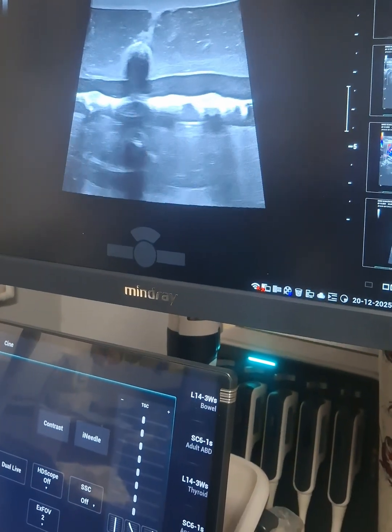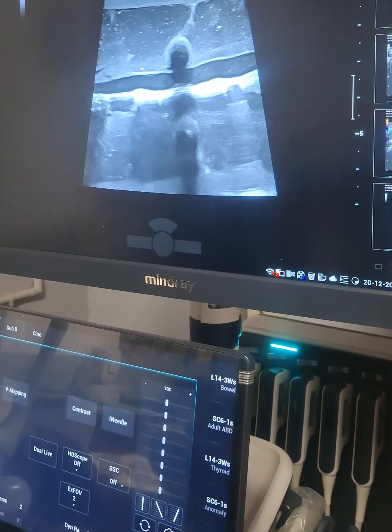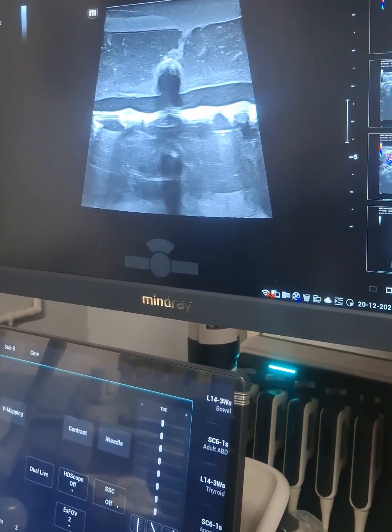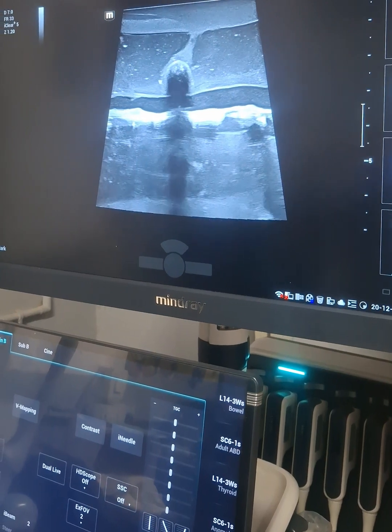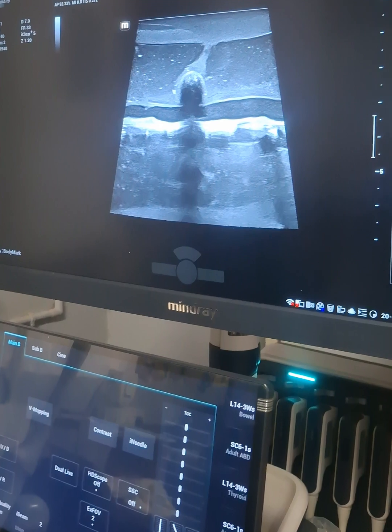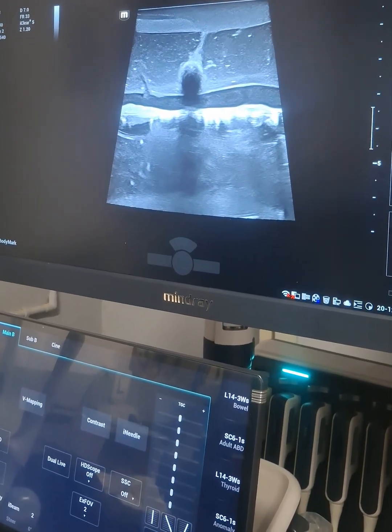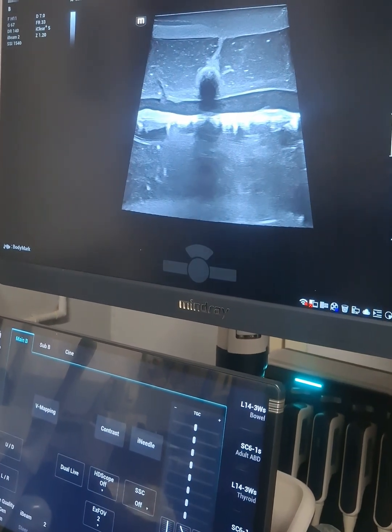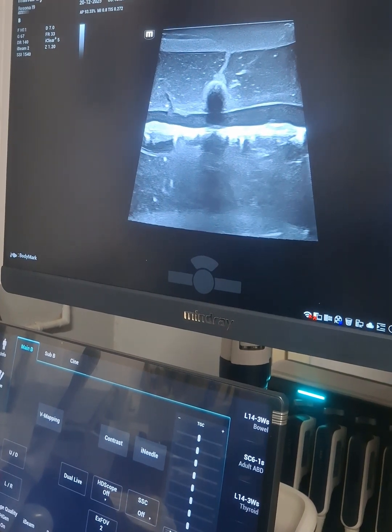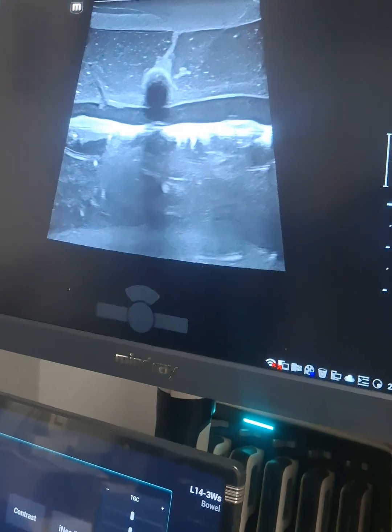This is how it looks. Using this USG phantom, you can practice doing FNACs, biopsies, or aspiration. You can see how nicely the needle is visualized in the phantom, so this is very good for beginners to practice.